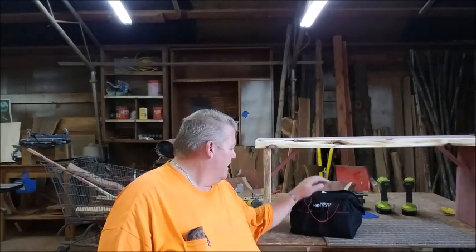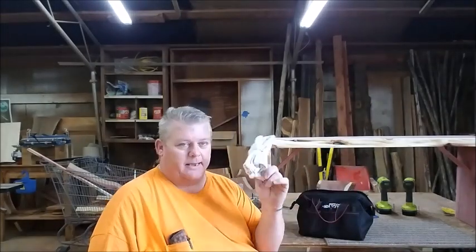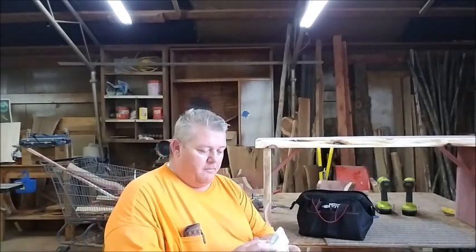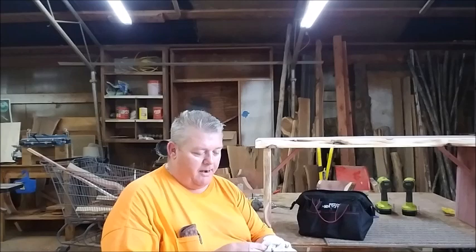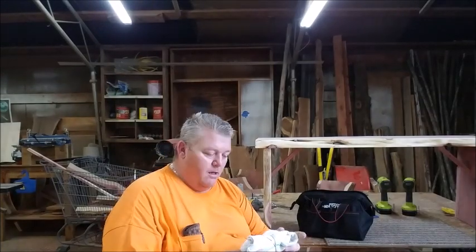Taking a break for a minute, wanted to talk to you fellow amputees out there. The important thing you need to remember is stump socks. I did a thing on man bags, yeah, I carry a man bag, proud of it. Carry stump socks. And my stump socks, they're colored. I don't know about everybody else's, but I got yellow, I got a green, and I got a blue. Each color represents a different layer. A yellow is 1 layer, a green is 3 layers, and a blue is 5.